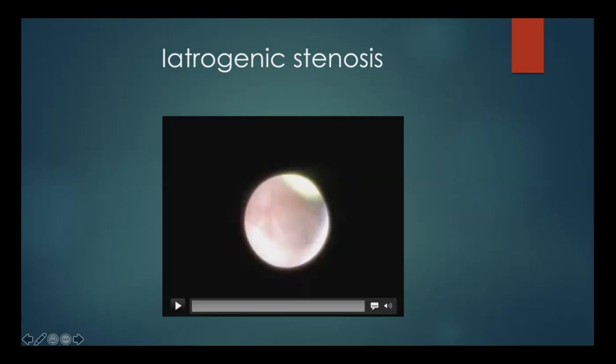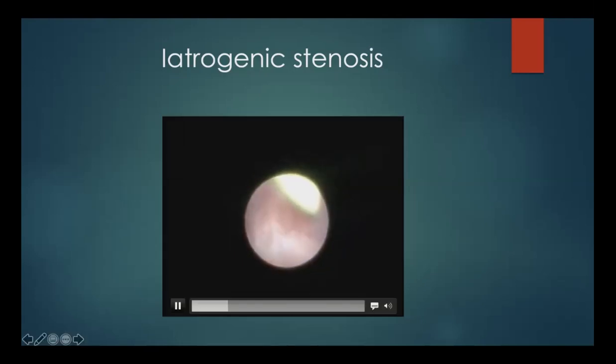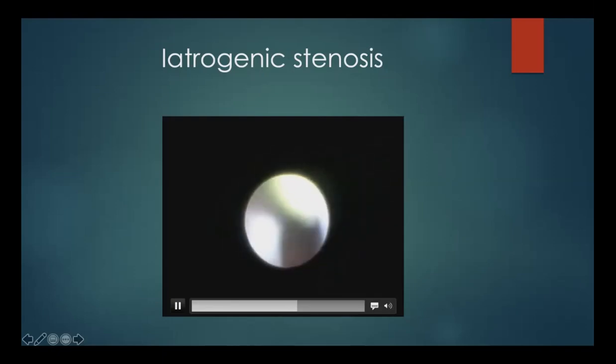This is a video where it's an iatrogenic injury by myself, in the sense that this was a laser sialolithiasis case, and laser does induce a lot of ductal fibrosis as well. So this is us doing dilatation, and this is what it looks like after dilatation of laser stenosis. You see a lot of mucus plugs right there, and once you withdraw, that's your stricture, which is what we had dilated over a guide wire.